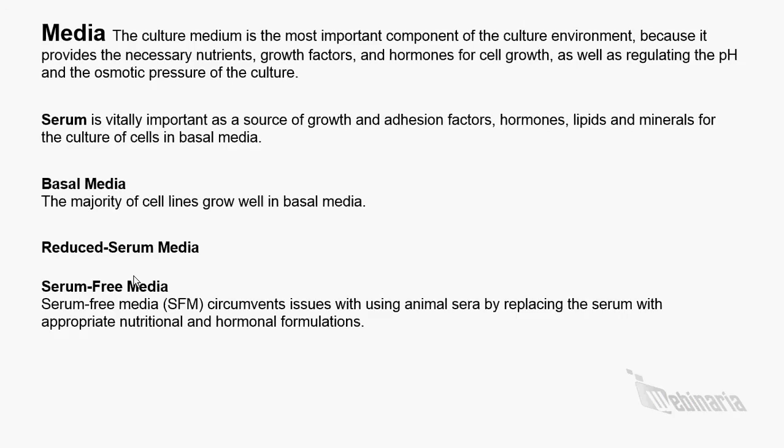However, using serum in media has a number of disadvantages, including high cost, problems with standardization, specificity, variability, and unwanted effects such as stimulation or inhibition of growth and or cellular functions in certain cell cultures. If the serum is not obtained from a reputable source, contamination can also pose a serious threat to successful cell culture experiments.